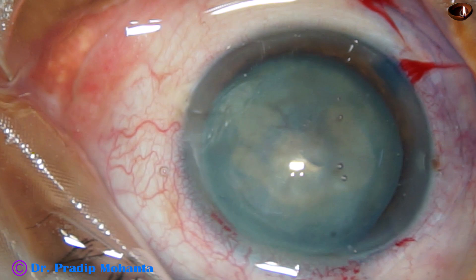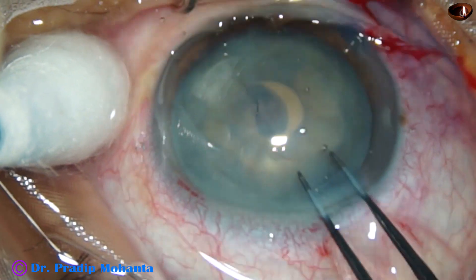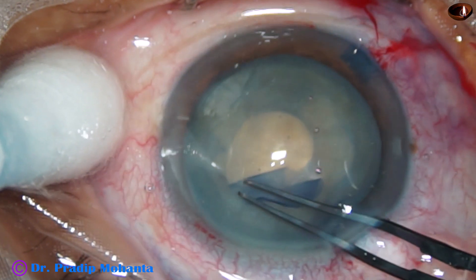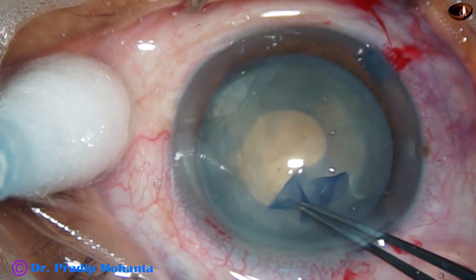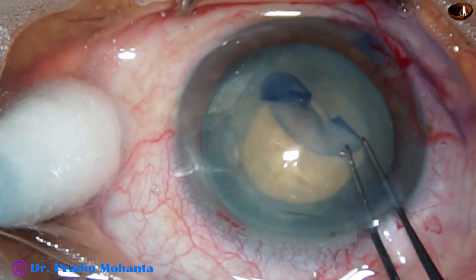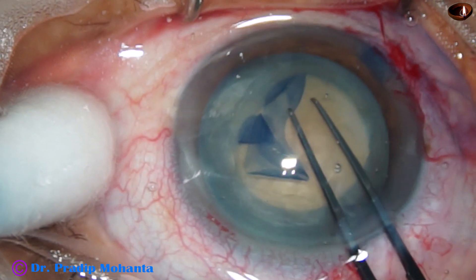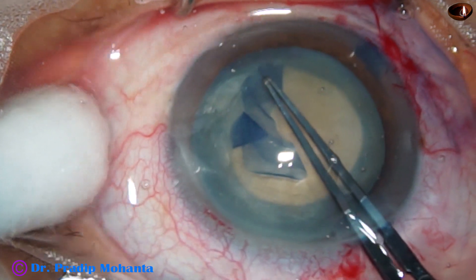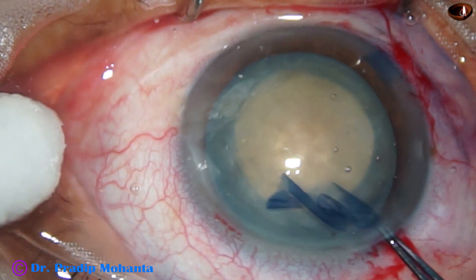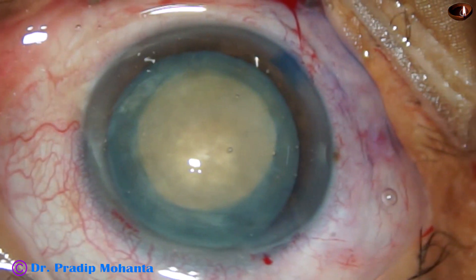And now visco is again injected. Then Utrata forceps is used to do spiral rhexis, starting with a small turn and now going to the periphery to make an adequate-sized rhexis. As I pull the capsule, I can make out that the zonule is strong in this case. There is no zonular weakness. And this has been a very nice, very satisfactory rhexis.